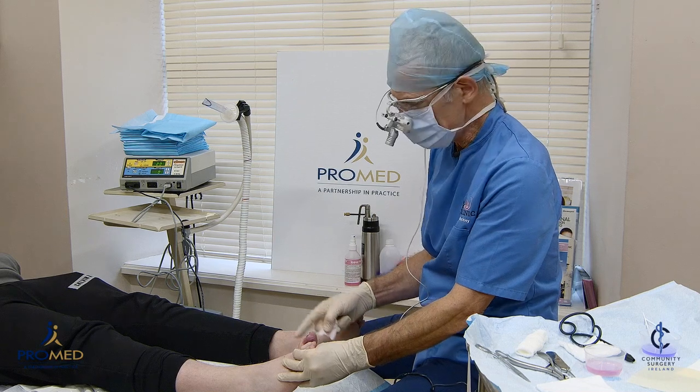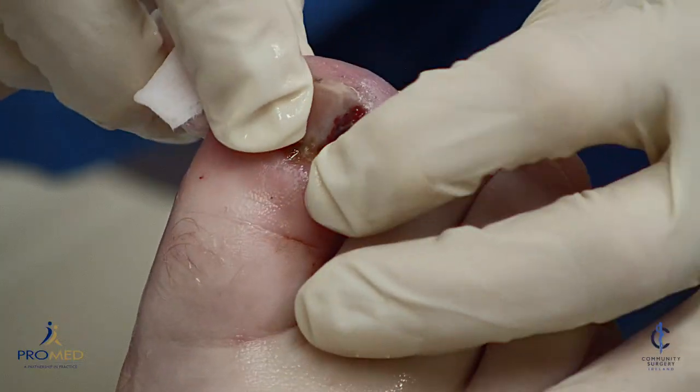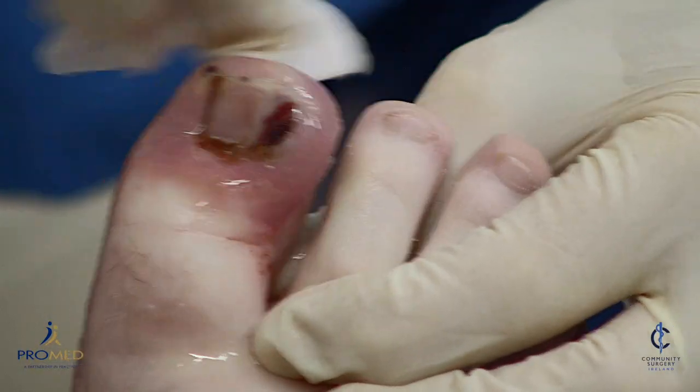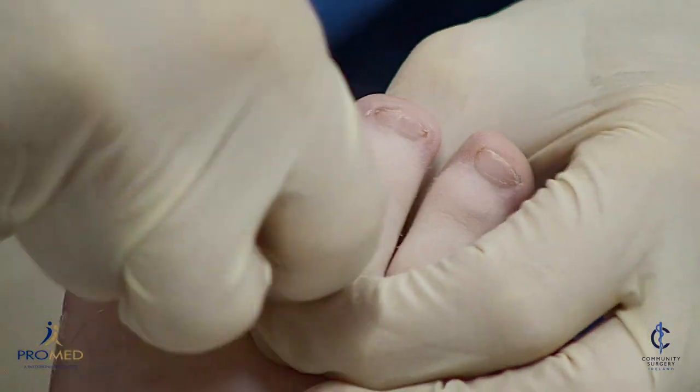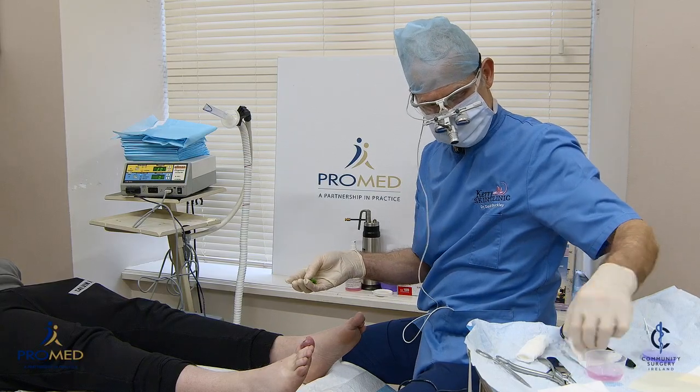Now we've had the anaesthetic in for ten minutes — a ring block with some local infiltration. It feels very numb, Scott. I'm going to clean the toe with some chlorhexidine, and then we're going to put on a tourniquet to try and minimize the bleeding, because blood interferes with everything.